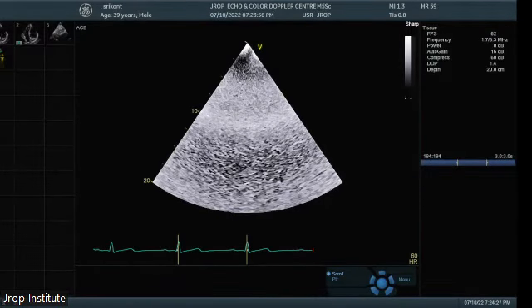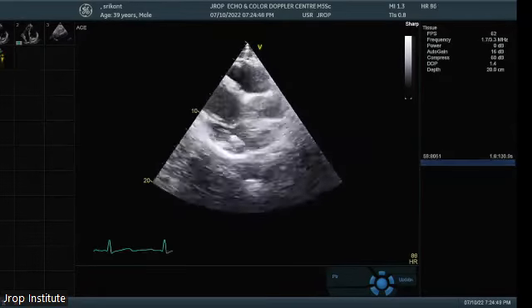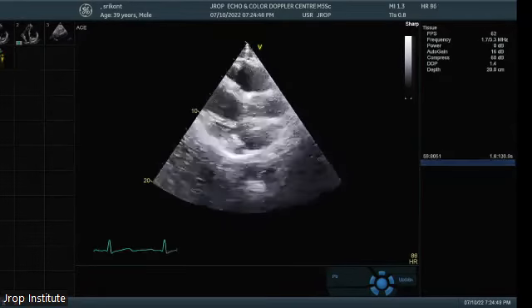Could you explain once again the parasternal short axis, three things together, so that I could correlate? One is the left ventricle base, mid and apex. The question is, in the parasternal short axis, where do you say base of the heart, mid segment of the heart, apical segment of the heart? That's right, Sunita?